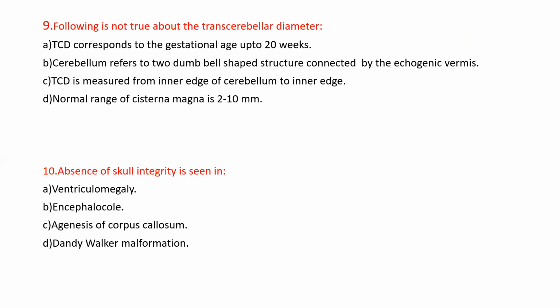Recently, I missed one at the 13 weeks plus scan and found it at 20 weeks, and I had shown the image to Professor Khurana. It was an occipital encephalocele. And the poor fetus was nicely moving about and active, and the mother was feeling nice. But it's a huge disappointment to the parents to see that this baby, which they conceived with such difficulty, has to be terminated. Yes. But these evolve also.